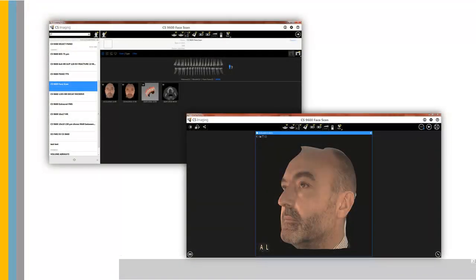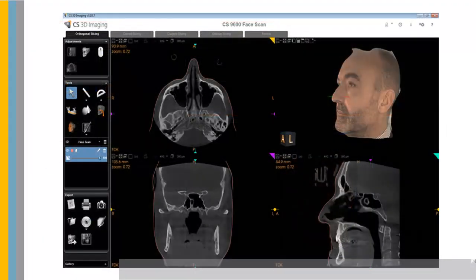You can view the image in CS Imaging Version 8 and CS3D Imaging.